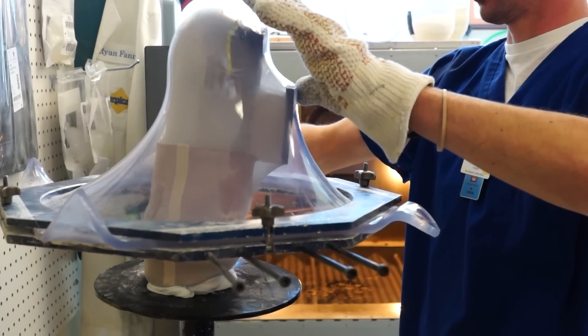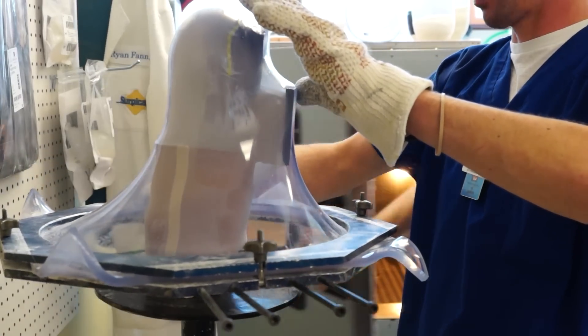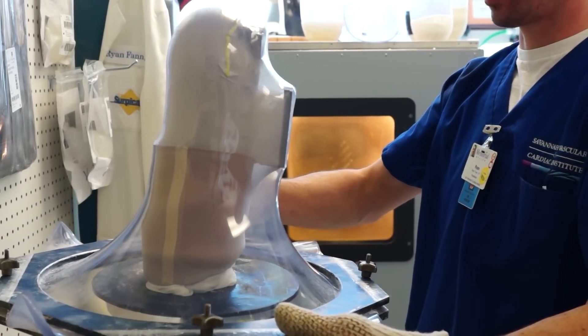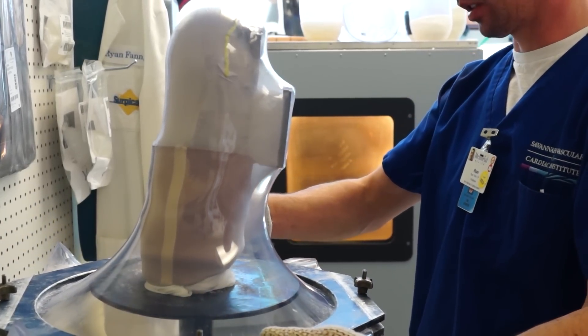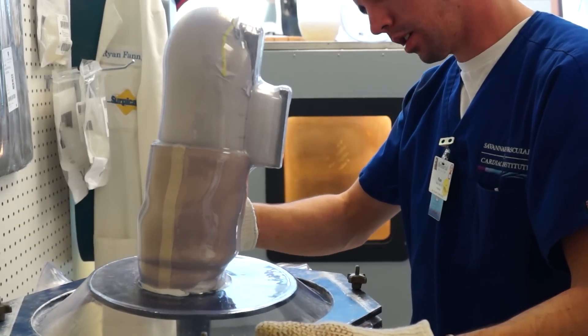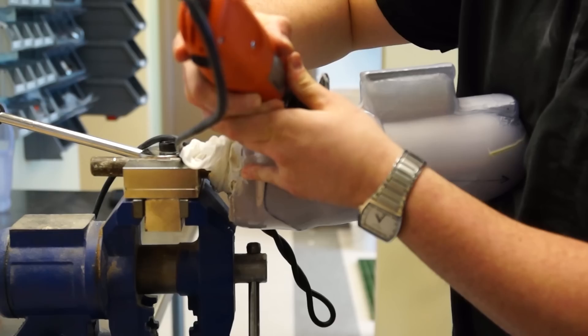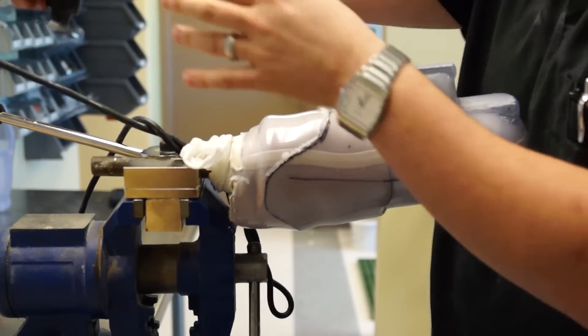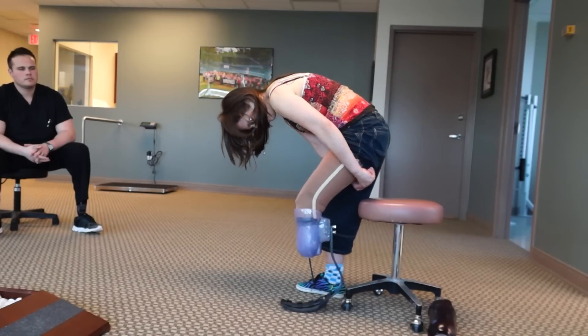A second check socket is being pulled over my first check socket, and they've attached a knee sleeve since I'll be using suction suspension for my running leg rather than my proximal lock. I'm using suction instead of a proximal lock for a more secure and intimately connected fit. After the plastic hardens, the socket has to be cut off of the mold. And now I have a test running leg.